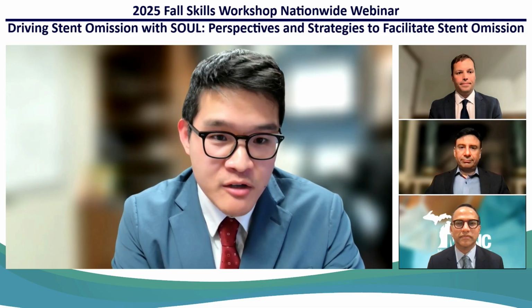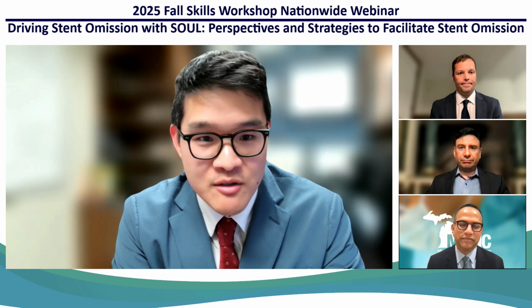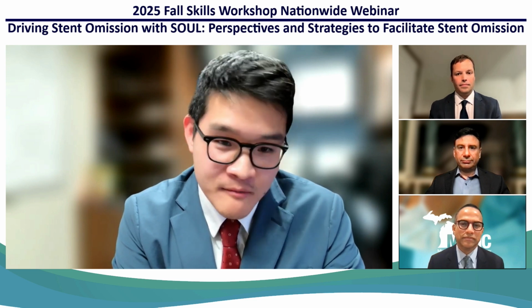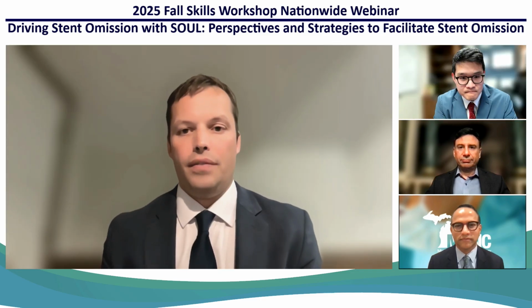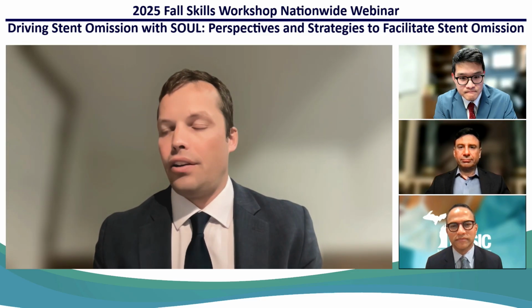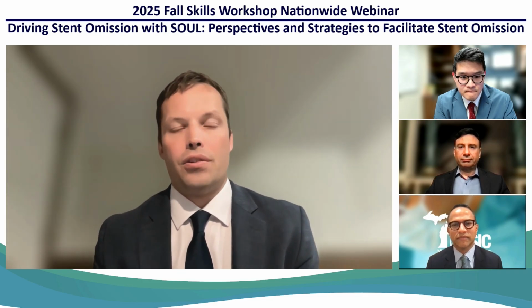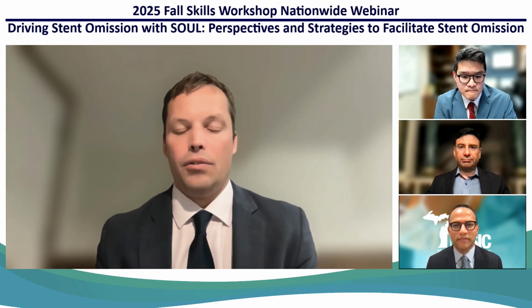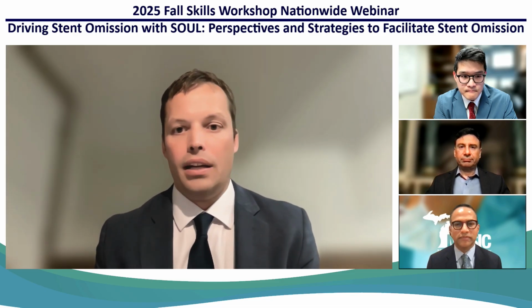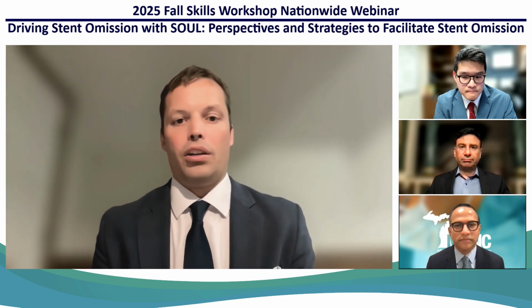It makes sense. And like Montu mentioned, it facilitates flexible ureteroscopy. And so there's a lot of benefits to it that may not be so easily capturable on pen and paper. Yeah, and I completely echo, Kirsty, we had that side conversation even today. In a scenario where turnover is often the limiting factor for us, not having to make sure that a tray that has your cystoscope, because it's not needed if you're using the 6.3 or 7.5, is present really minimizes what we need to open for each of these cases. Have everything available for safety, but I think there's no doubt that could have a benefit on turnover, and that may flip the value argument completely on its head.